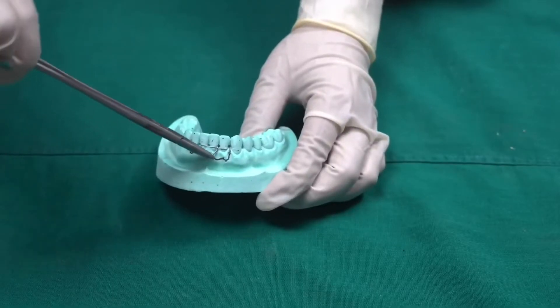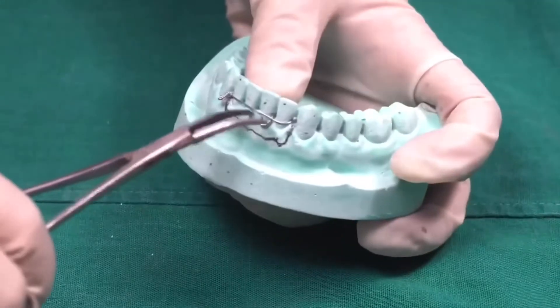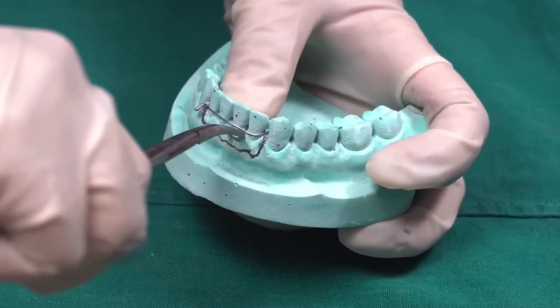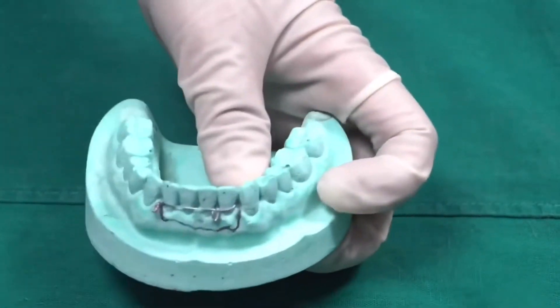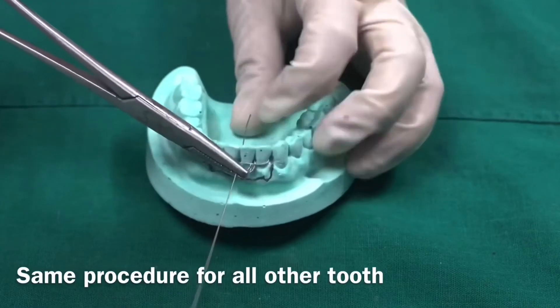Tuck the wire into the interdental region with a needle holder. Use an artery forcep if you find it difficult with a needle holder. Using the same procedure, we will do it for each remaining tooth.